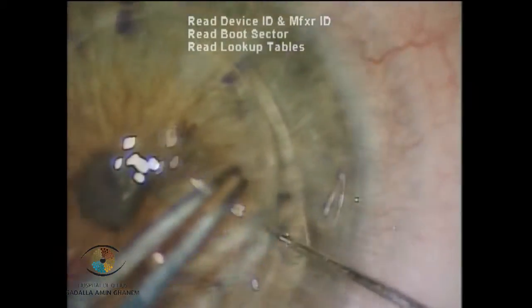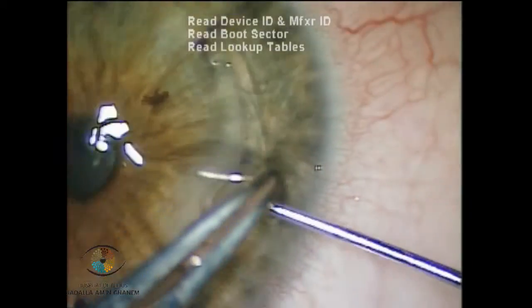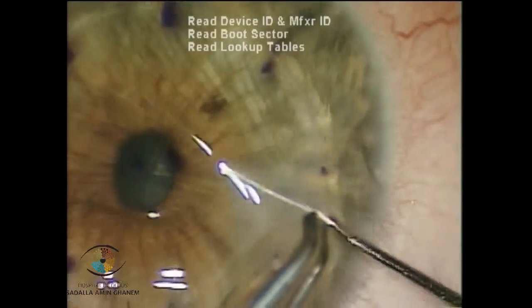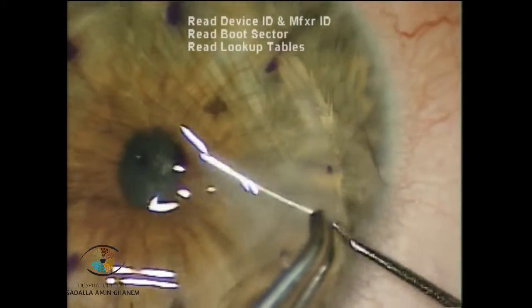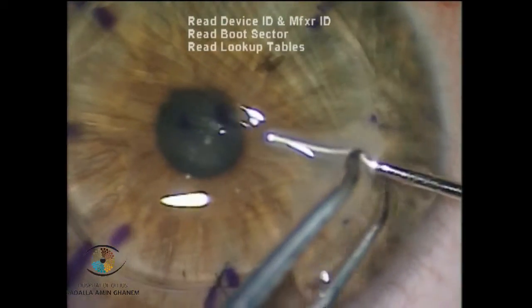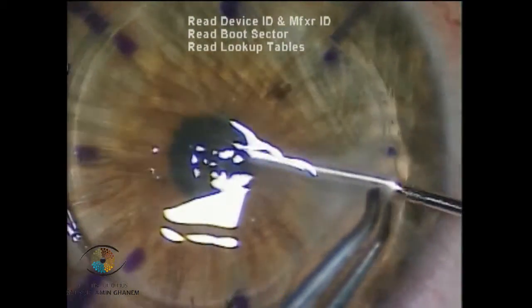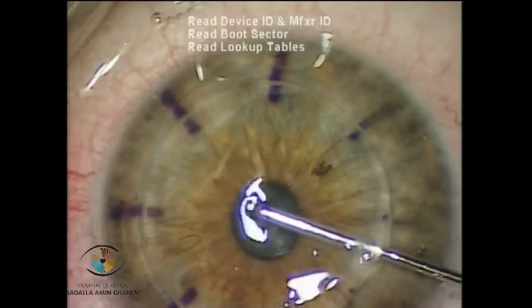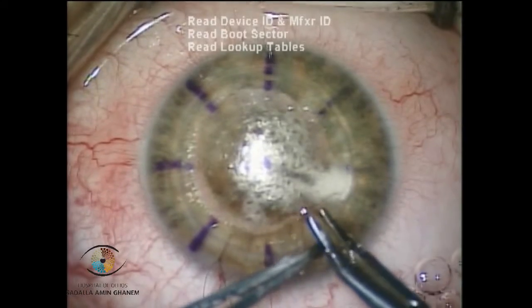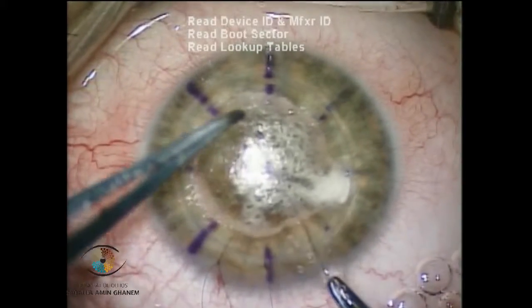Close to the area of trephanation where there is no perforation, you may perform a deep tunnel that reaches the central stroma, where you can inject air and try to form the bubble. Here you can see the bubble is achieved, and this may facilitate the conclusion of the surgery as a DALK surgery.